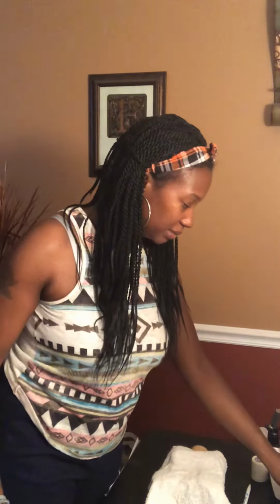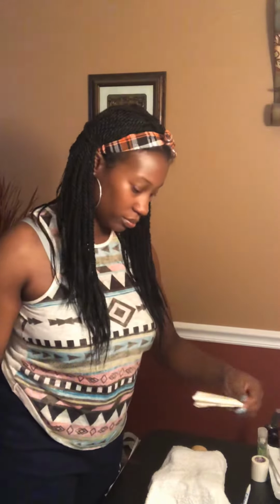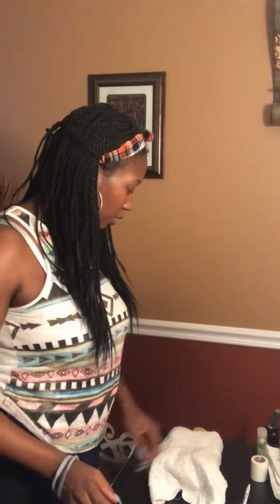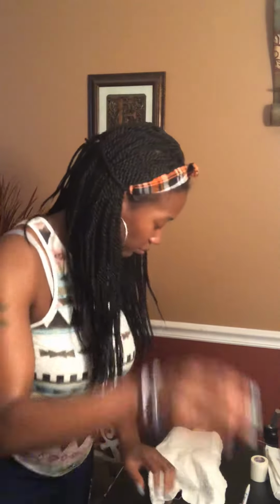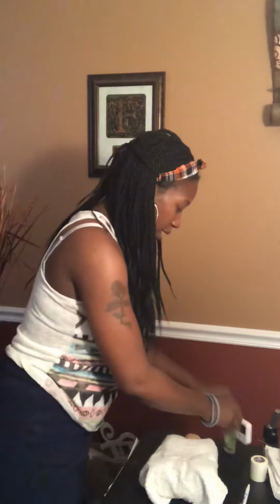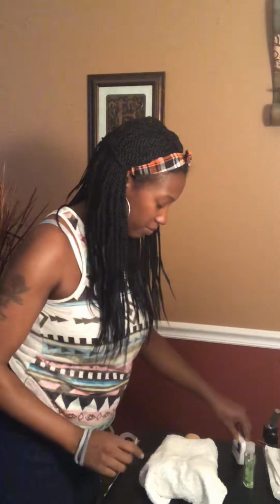And I'm going to get my sterile gloves. That's a large. Kit and sterile gloves. Got it? So, that's all you need. I have the gel and the timer over here. We don't need a pen or tape. Got that.